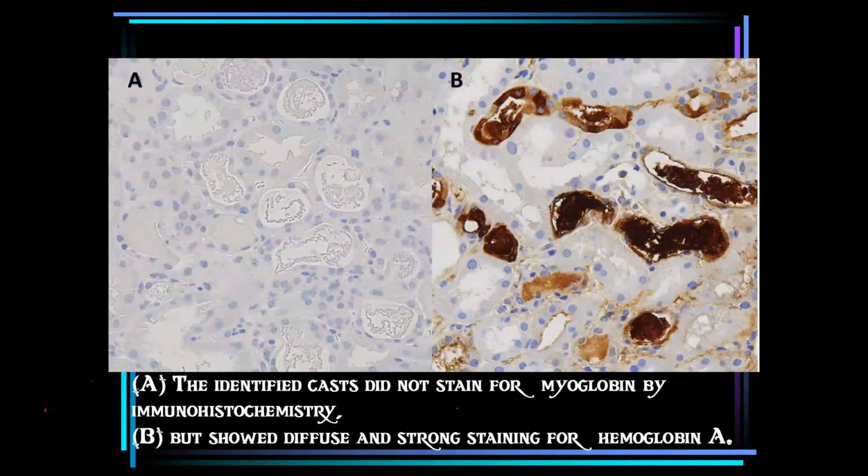This is after making immunohistochemistry in this patient with granular cast, the immunohistochemistry against hemoglobin A. It will give a positive staining, as we see here. So in this immunohistochemistry finding, this is the documentation in pathological terms that it is a hemoglobin cast.